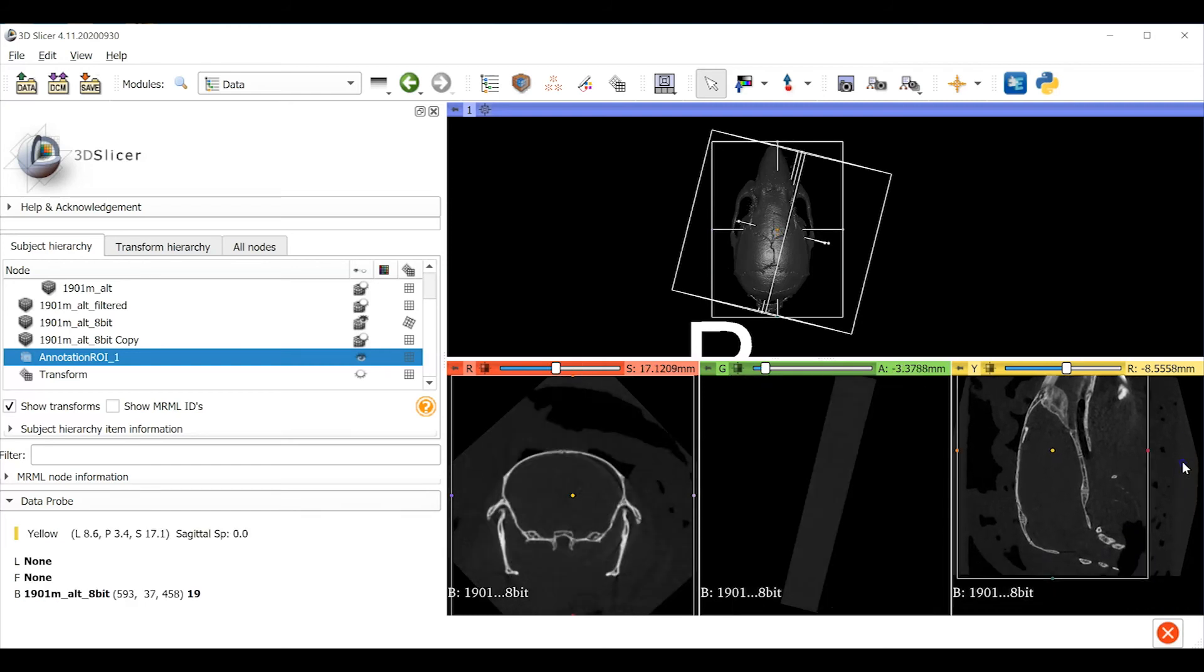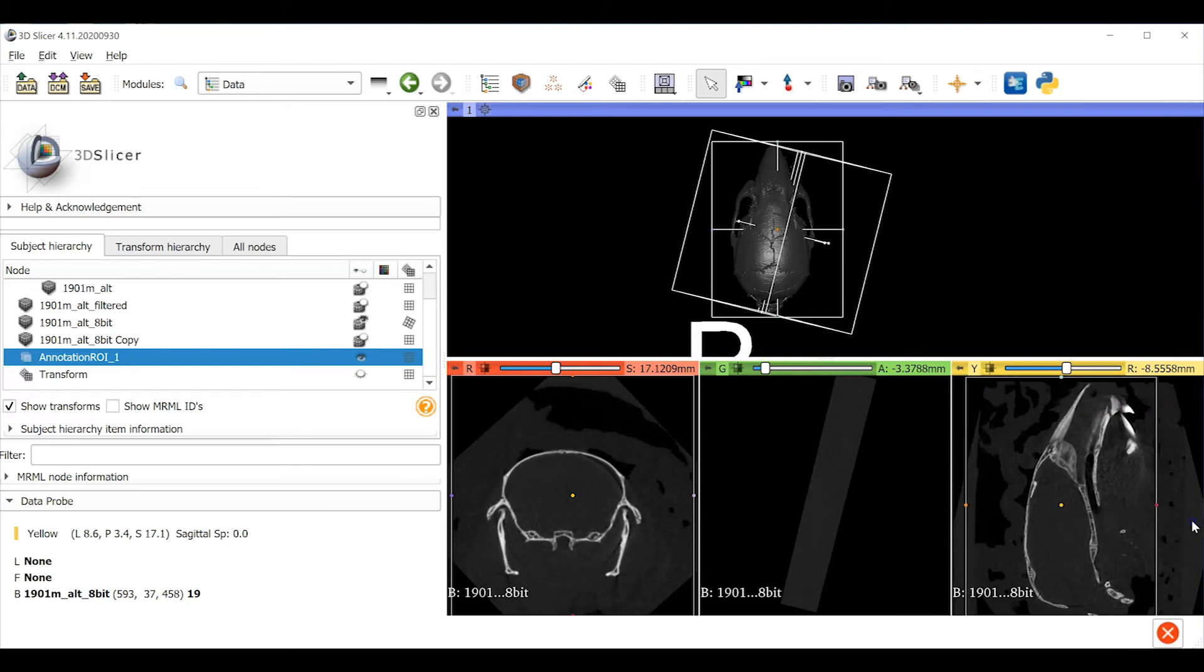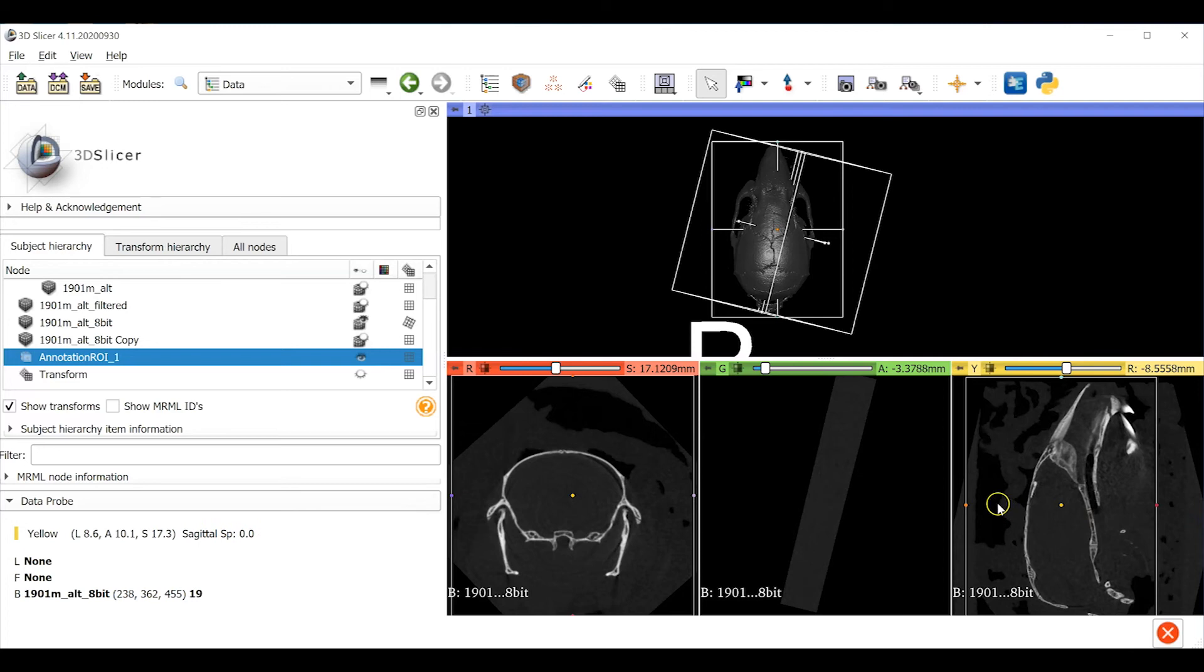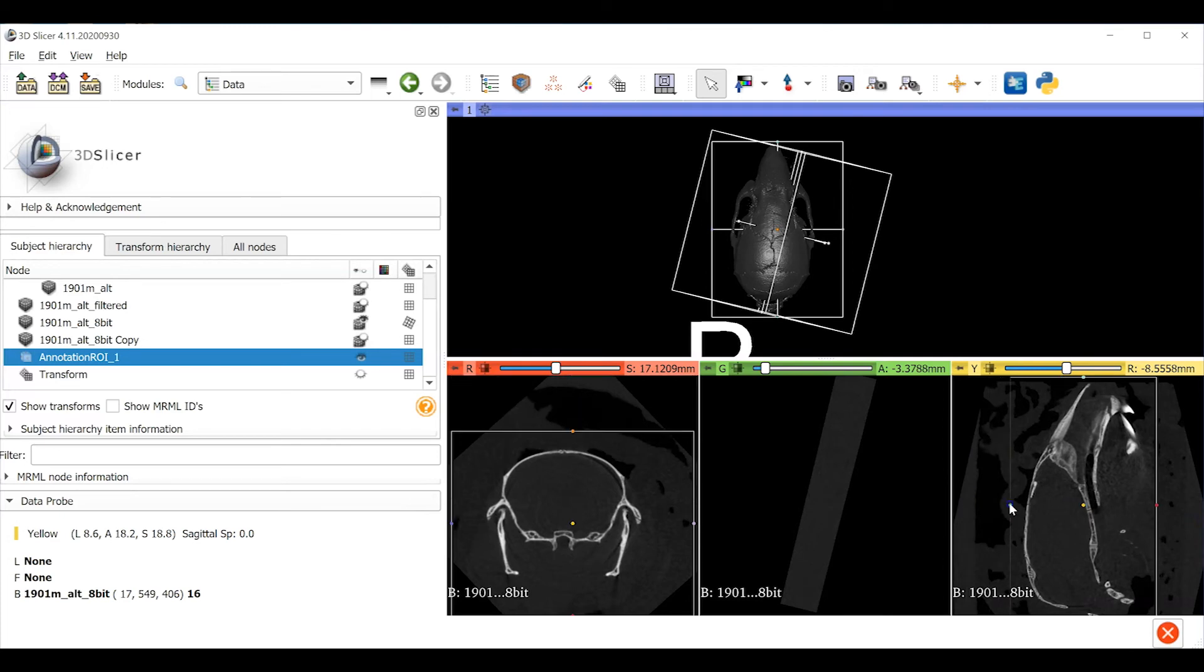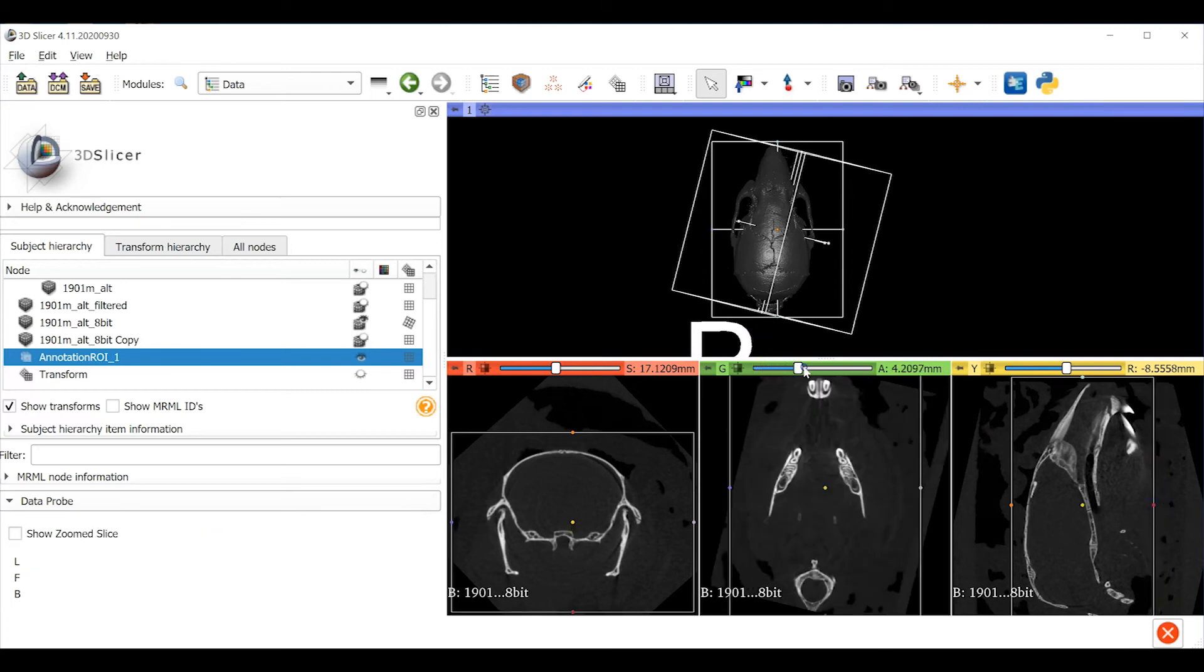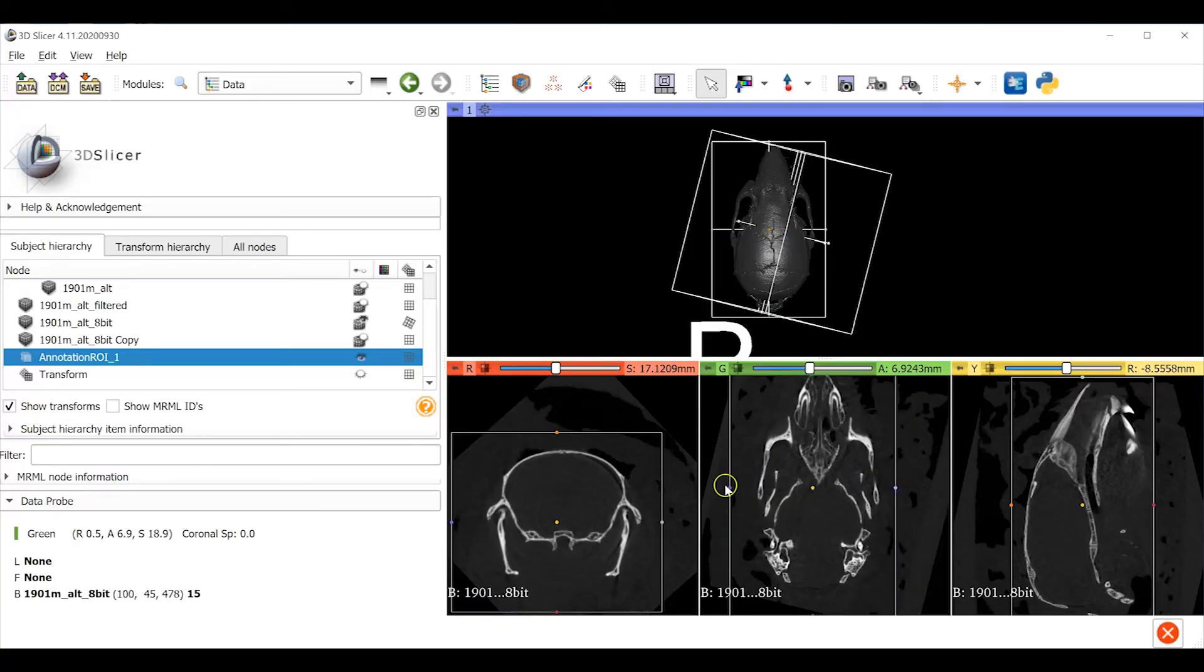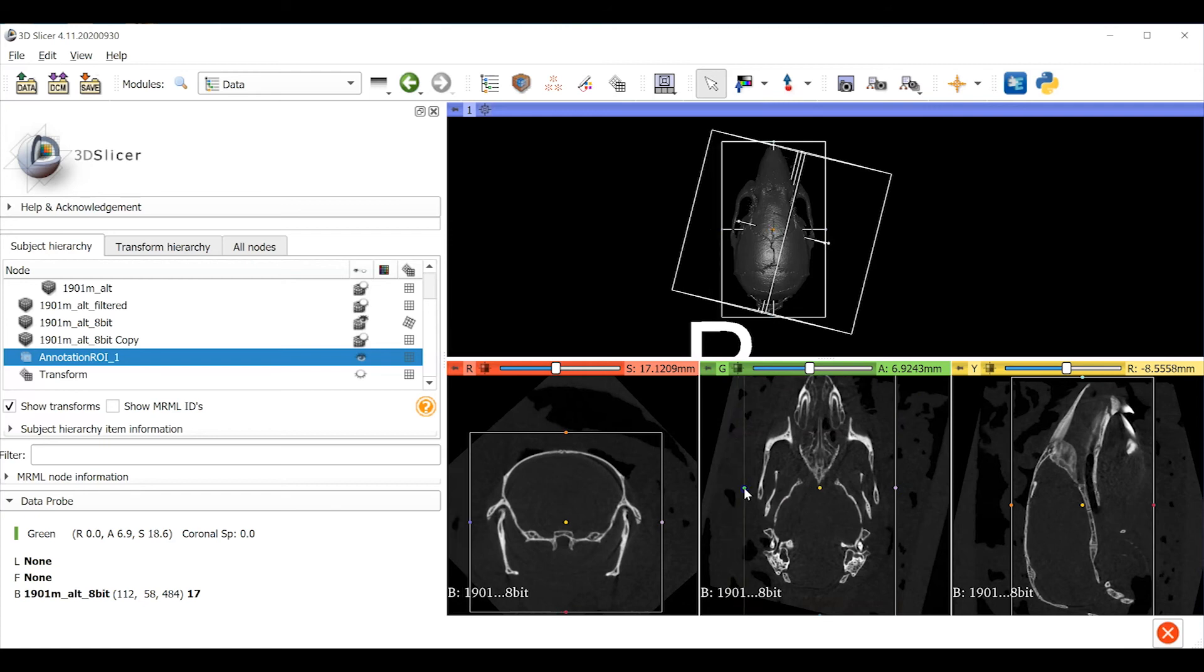I have the viewer set to jump slices so when I clicked in the frame there it shifted the position of the other slices. Keep your eye on the lower right viewer. See how the dorsal edge of the ROI is far from the roof of the skull. This means that there's a whole lot of information in the volume that's not contributing to our reconstruction of the skull. We're going to remove those wasted voxels by sliding the ROI closer to the skull. I'm moving to the lower center viewer now and scrolling up to the widest part of the skull. I'm going to use the draggers to adjust the ROI to be closer to the skull on the right and the left sides.